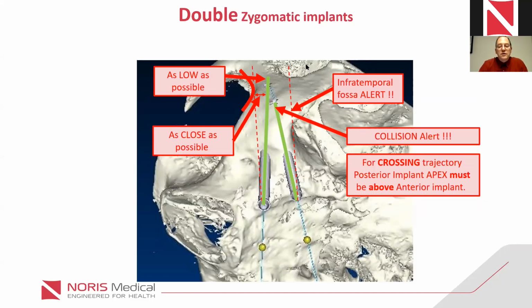Roberto, hi, compliments. Do you use some guides to position the implants? Roberto, yes, we do use guides. We have developed a very unique guiding system, which is called Zygoma, and there is a session on the 6th, next Monday. I'm going to have a session on the Zygoma guiding system, and you will see how we do it. And this is answering your question.